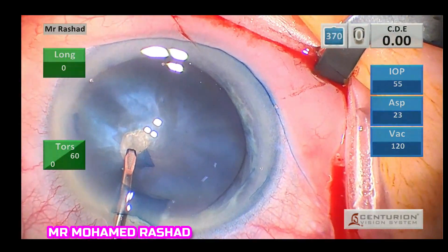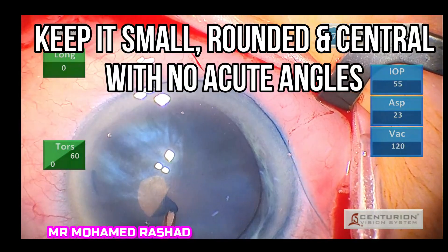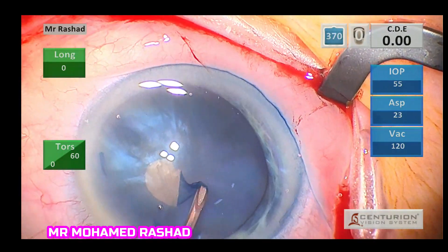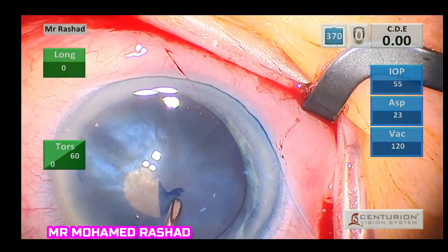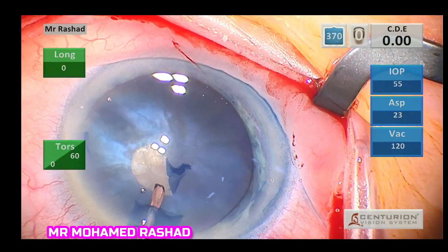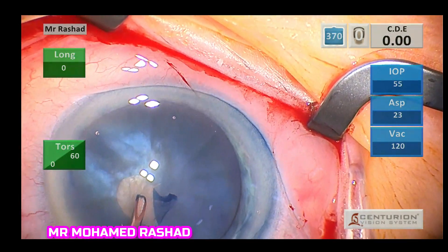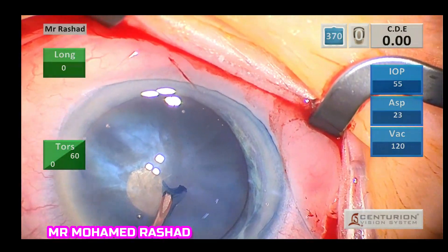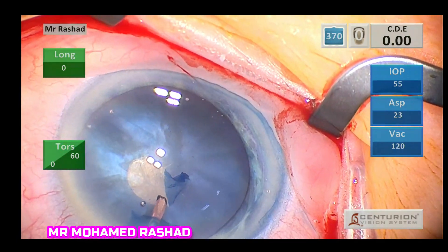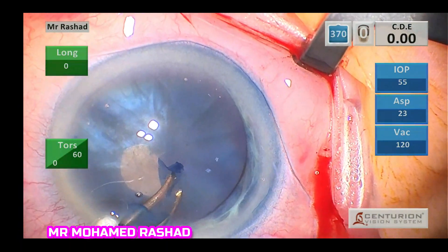You do a good staining of the capsule and puncture the center of the capsule, and see how the rhexis is going to behave with flattening of the anterior capsule. Always remember to keep it small, rounded, and central.